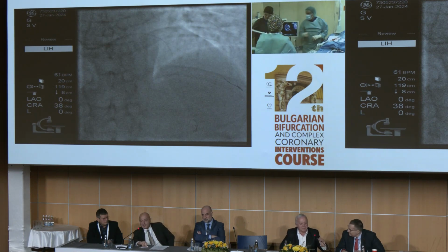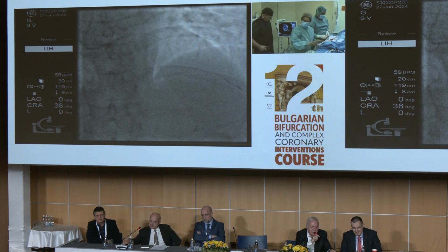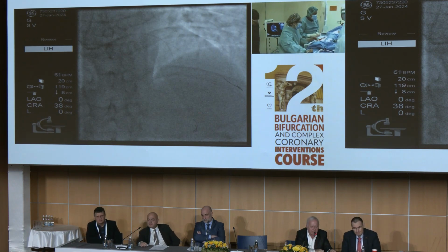You can show me that, okay. So, Juan, you will pre-dilate with which balloon? 3.0?